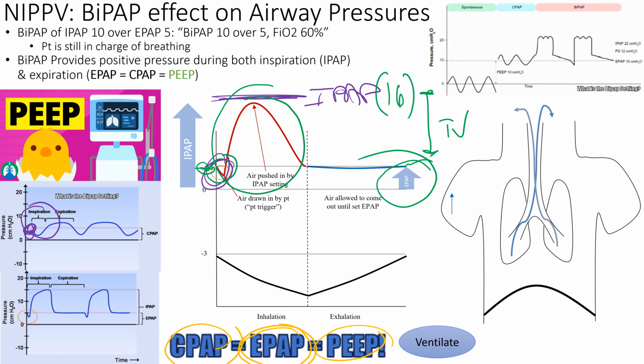So you can see here is a normal CPAP waveform. All it does is push the normal waveform up. So this CPAP of what?